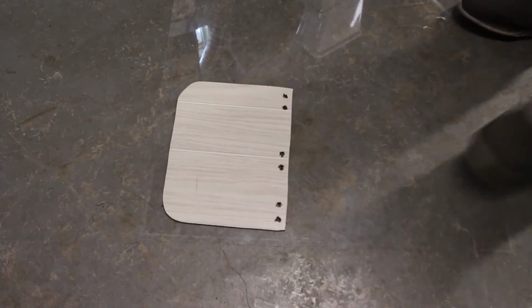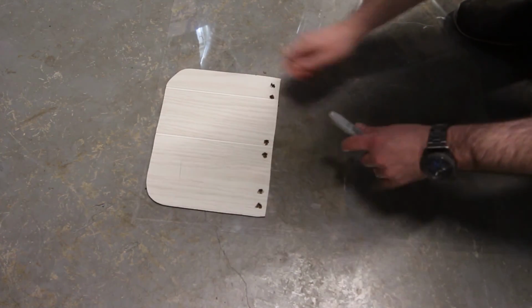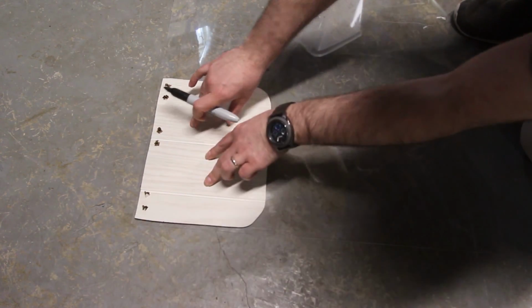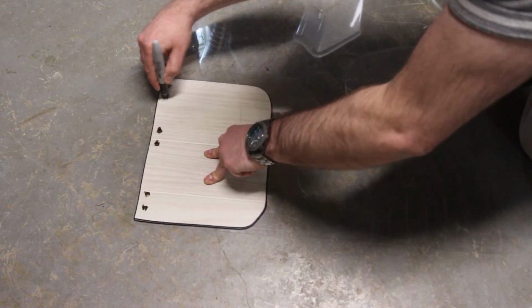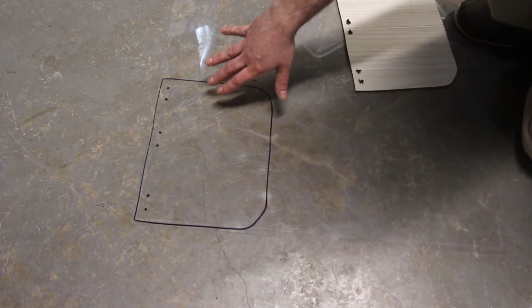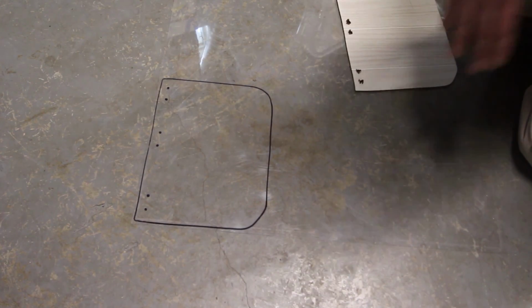Okay, so now we have our face shield template, and I have a sheet of plastic here. It came out of a 24 by 36 inch poster frame. I'm not sure if it's plexiglass or some sort of poly, but it's clear, it's flexible, it's thin, so we're gonna use it. So let's put our template over here towards the edge and then trace it with a magic marker or a Sharpie. Okay, now if everything works as planned, we cut out this plastic with an X-Acto knife, a pair of scissors, and we'll probably use a drill again for the holes here. Hopefully everything lines up, and hopefully this will work as our face shield.